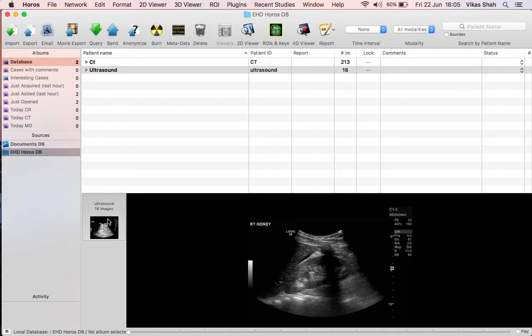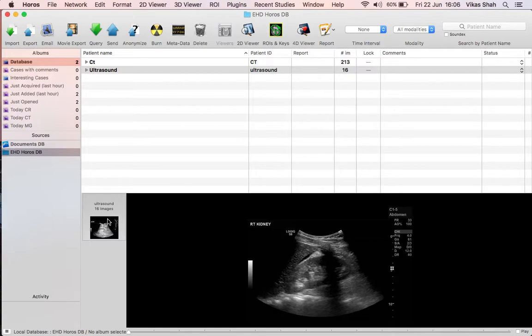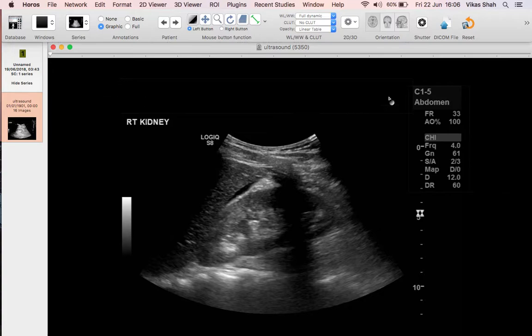Let's start off with an ultrasound study. On ultrasound and nuclear medicine studies you'll find patient demographic information often embedded or burnt onto the images, and that must be removed before you upload the images to Radiopedia. I've already redacted the demographic information which is usually found at the top of the image, but I'm going to show you the technique I used to remove this information down here on the right.